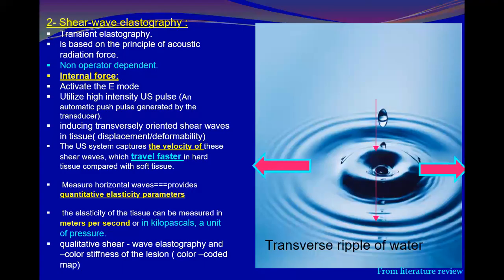What is shear wave elastography? We said the strain is static elastography and is operator dependent, because it depends on using pressure or compression by the transducer, and it's relatively subjective. But shear wave elastography doesn't use external force. It uses an internal force from the transducer.